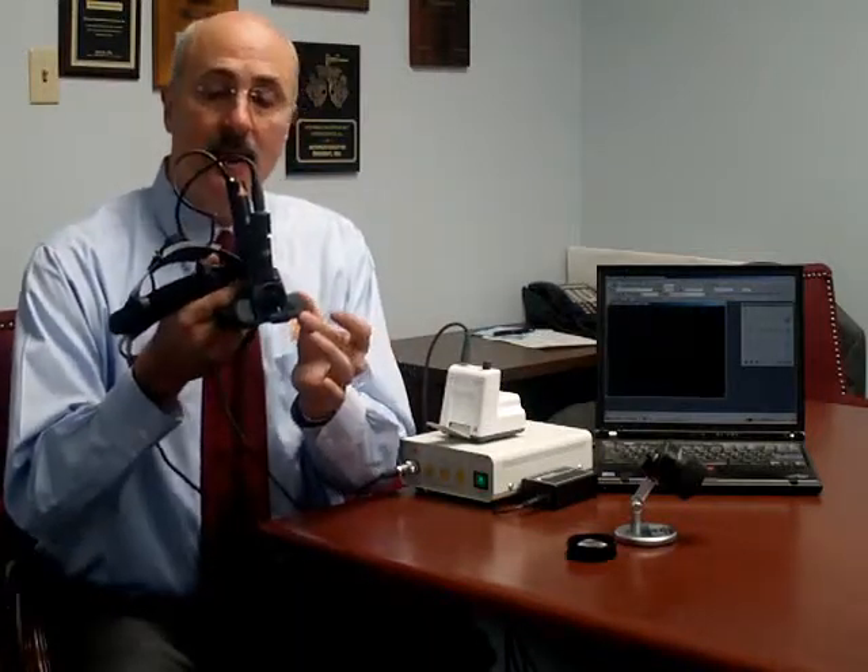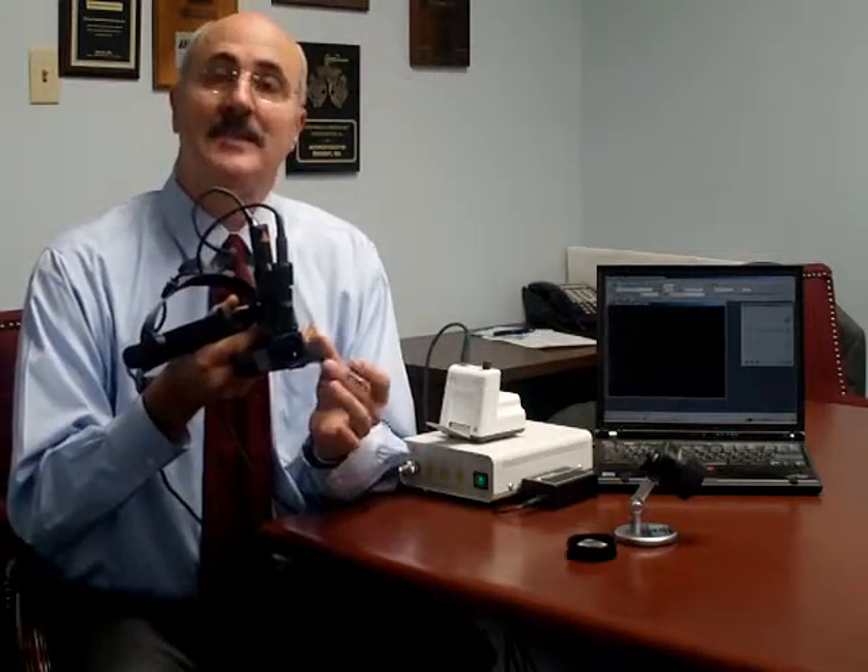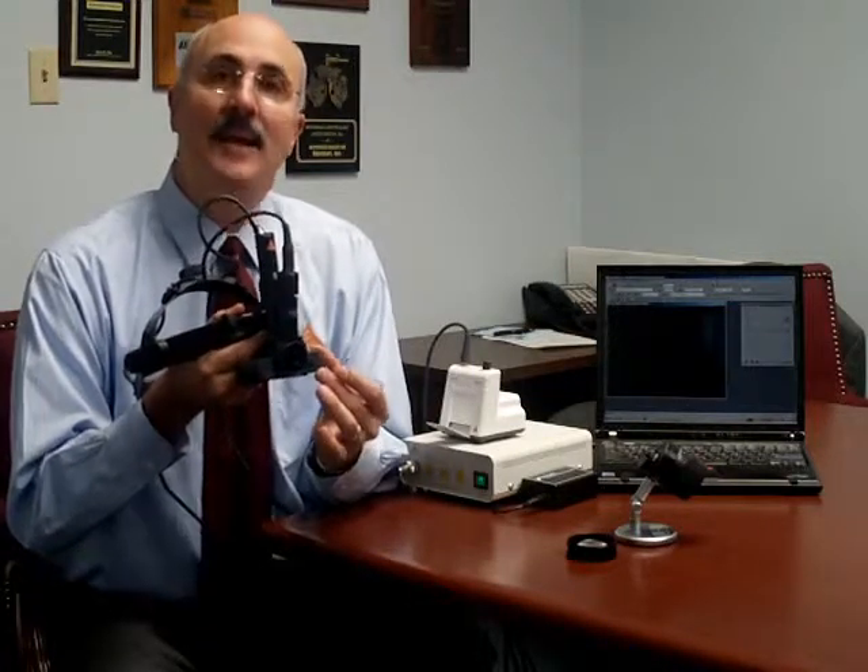The key advantages to this are that the alignment of the optics stays perfect every time that you use it, and we don't have to incorporate a beam splitter to generate the video image, which means you get a much brighter image with much better patient compliance because you don't have to crank the light intensity up so high with this instrument.